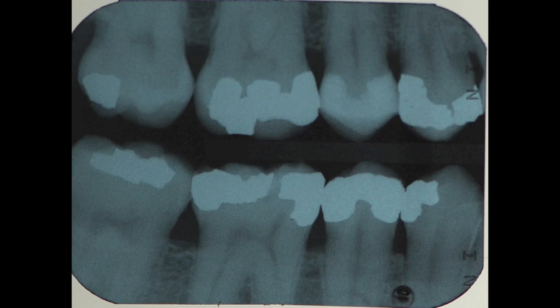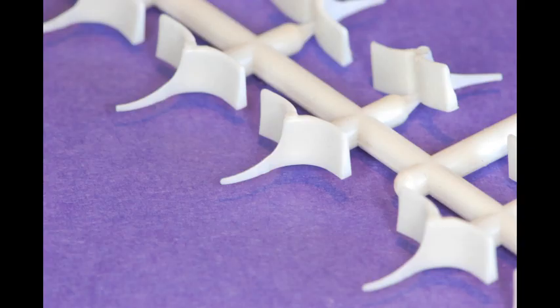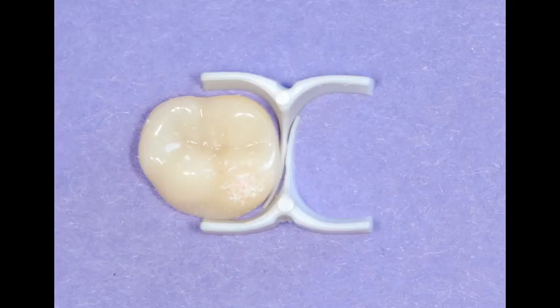This tooth was pre-wedged to start the separation process, and then four ABC wedges were utilized to support the matrix band and maintain separation with the Danville mega rings. The ABC wedges can be used alone or in pairs. They are available in four sizes — extra small, small, medium, and large. All four sizes are packaged with a left or right curvature to adapt to the natural anatomy of the tooth. When using them in pairs, always use the same direction.